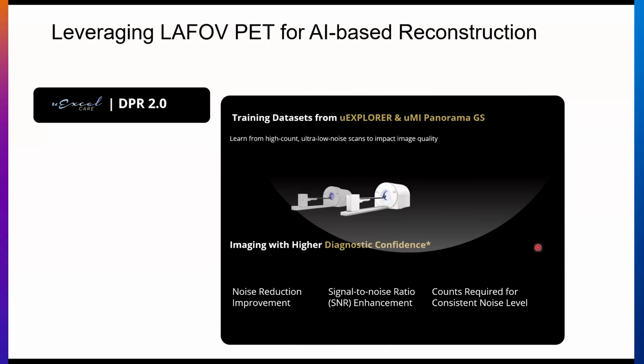long-axis systems, which are acquired under optimal conditions, and you can apply those learnings from the data distributions and the noise distributions to deploy this image quality to systems with different characteristics, so shorter axial field of view or different detector configurations, etc. So not only does it have its own inherent worth of having these long axis systems, but it also enables us to trickle down the knowledge of the data that we're acquiring into the rest of the fleet, even existing scanners out in the field.